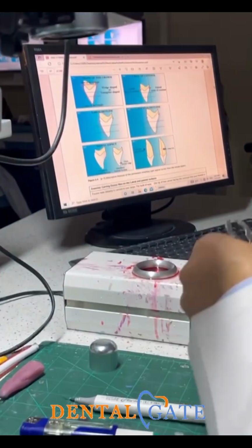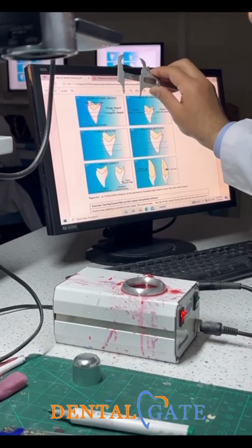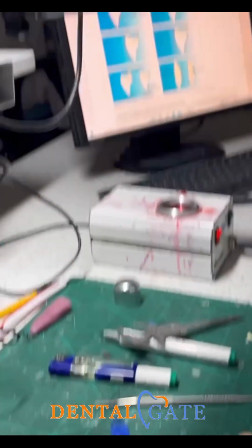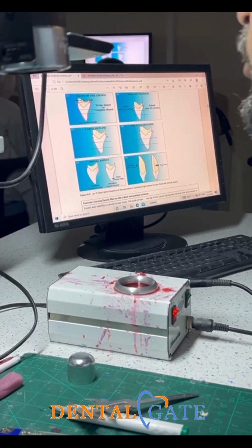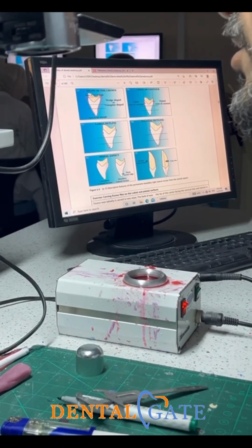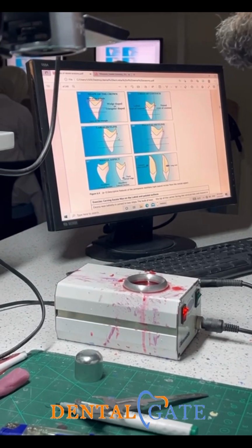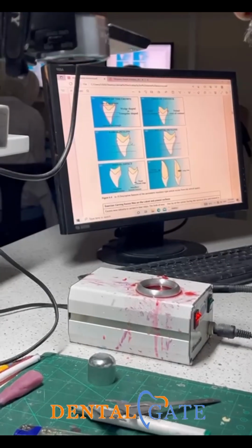So yeah, that means when I put my vernier here upon the shape of the lateral, we had 2 contacts only at the cervical. When I put my vernier, the poly gauge, here, there is 1 contact here, there is 1 contact here only. Because if I make a contact here, there is no equal one on the other side. So it will contact only at the maximum convexity. So there is no problem. I will depend it upon the shape.